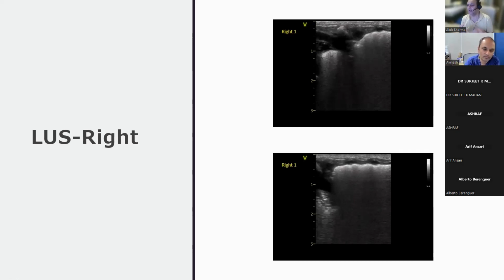No pneumothorax. Okay. Is there evidence to suggest any kind of fractal sign or acute pneumonic consolidation? No. Okay. Is there widespread atelectasis of both lungs that needs recruitment? No, in the right upper lobe, but not widespread. There's sort of homogeneity in the rest of the lung.